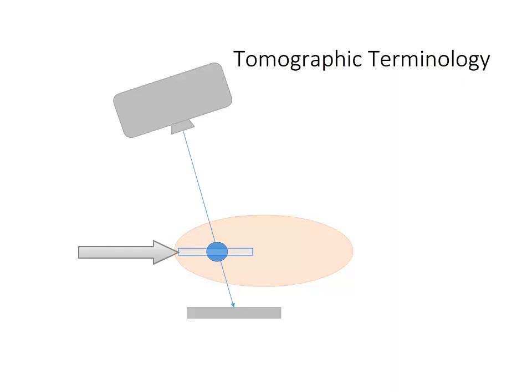The focal plane is the area at the same level of the fulcrum that is recorded on the image. This is sometimes referred to as the level, slice, or cut. You should be familiar with all of those terms describing the level of the fulcrum.